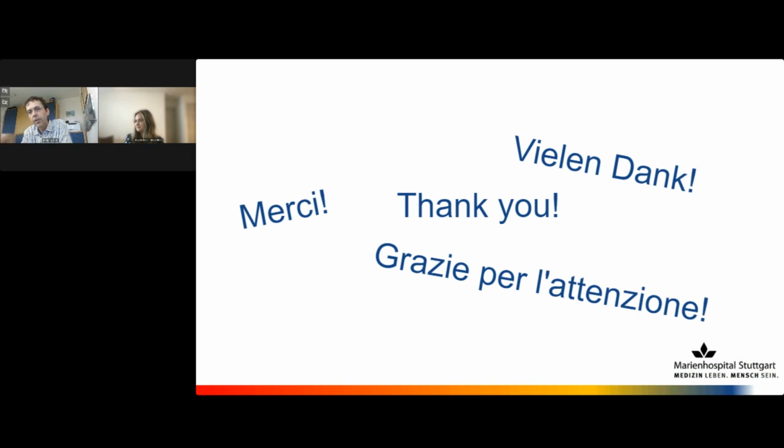Therefore, I think the lambda reference ranges fit quite well, but the biggest concern is kappa, and the kappa is by far too low, because essentially all patients we do the testing on have some renal impairment. I think this is a very simple explanation for the too low kappa values in the old reference range, and so there has to be an adjustment of this kappa. Yes. Okay.